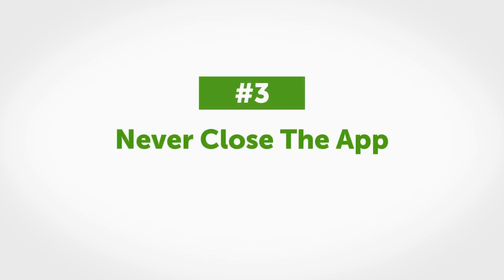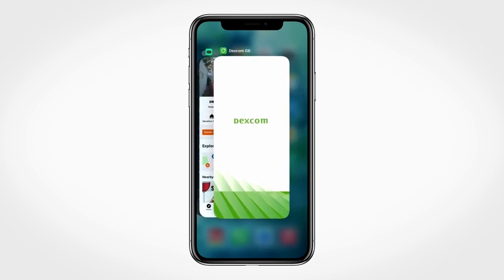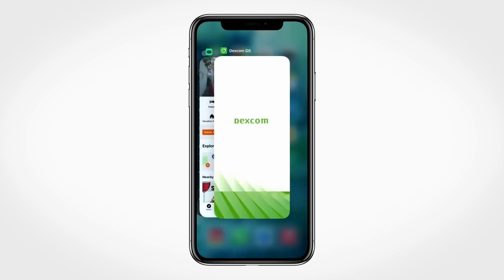Tip number three: the app must always be running in the background of your smart device. Do not swipe and close the app. If you restart your smart device, you must reopen the Dexcom G6 app.